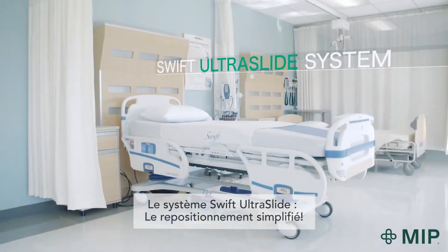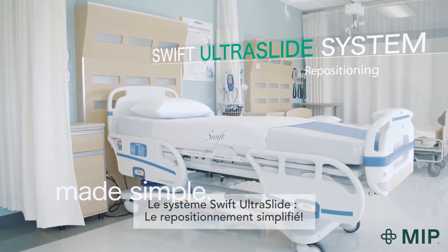The Swift Ultraslide system. Repositioning made simple. Made possible.